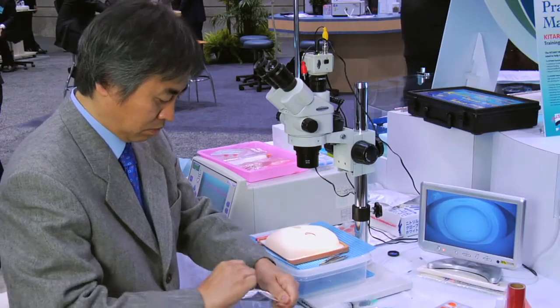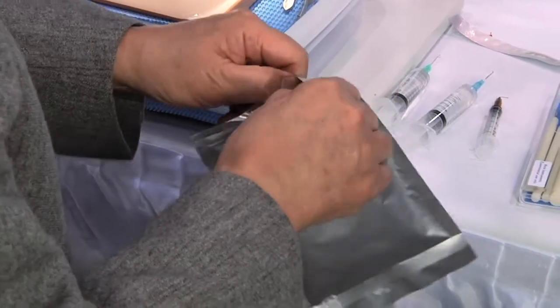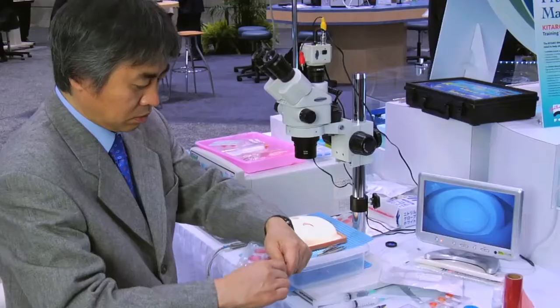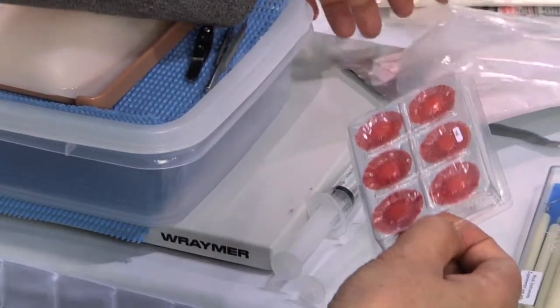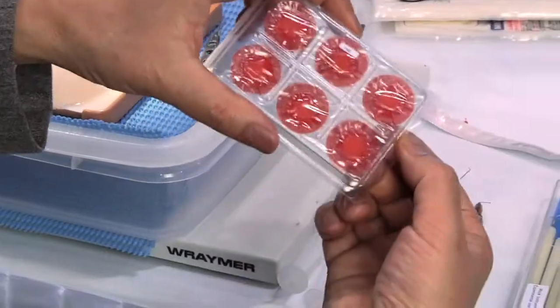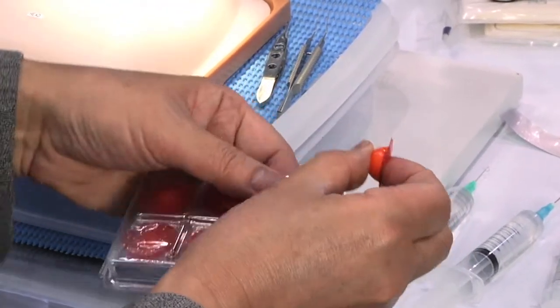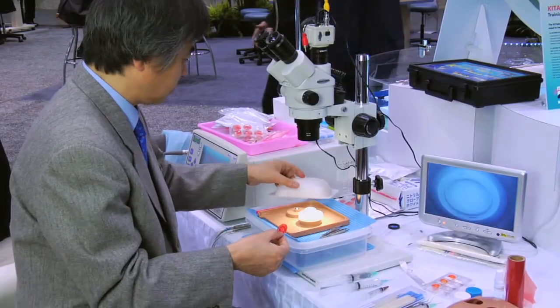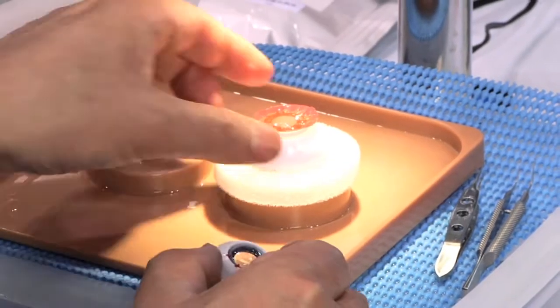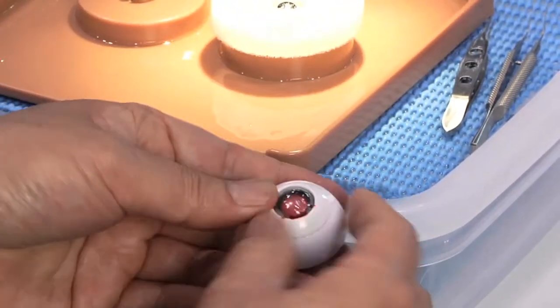Now the surgeon will prepare for the wet lab phaco procedure. The realistic single-use cataracts come in three different cataract densities: soft, medium, and hard. They are contained within an artificial anterior and posterior capsule foam. The cataracts are packaged in a resealable foil pack which is refrigerated upon receipt and will last in the refrigerator for about six to eight months. The cataracts are placed in the reusable scleral shell and a wet lab cornea is mounted on top.